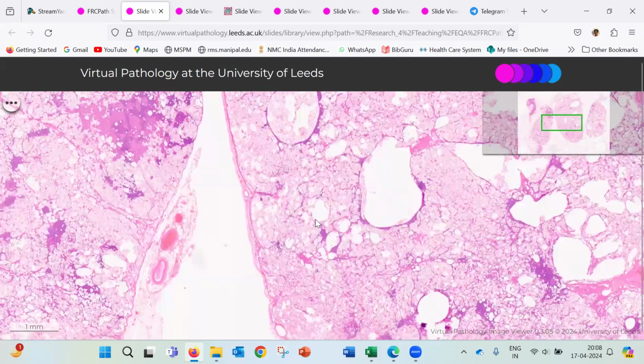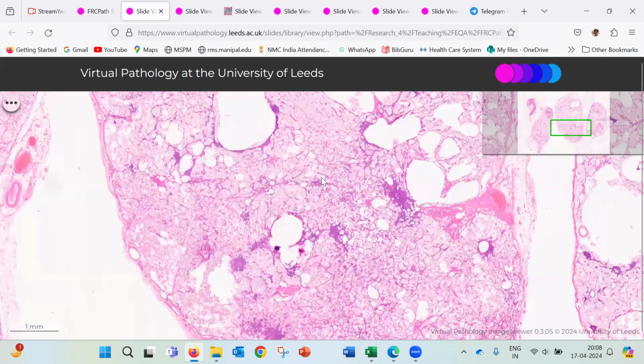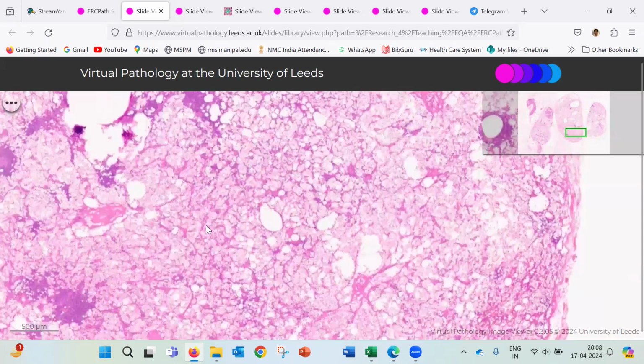the silicone part you can confirm with the previous surgery and the silicone implant that has been done, and with polarized microscopy, which will show a kind of birefringence of the silicone element.